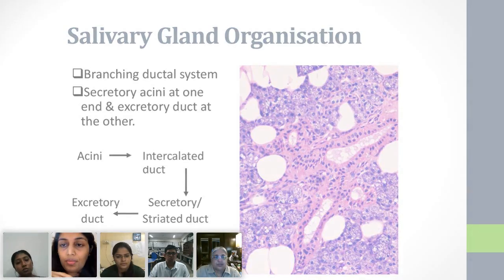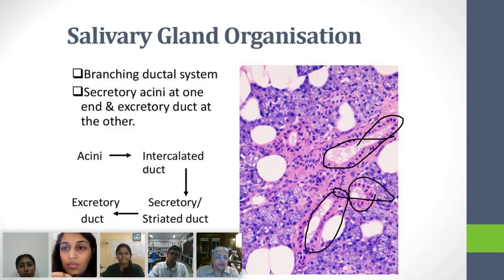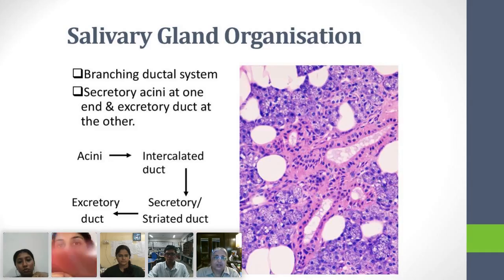And I will show you where that striated duct is. This is the striated duct. Over here, you can see another one, and you see another one over here. It's so pink and it has an oncocytic appearance. It is called, for some reason, the secretory duct. I have never understood why. And then there is an excretory duct. Can any one of you who's taking this, Neelam? Yes, ma'am. Can you show me where the intercalated duct is? I've shown you where the secretory ducts are, the striated duct. Now, show me where the intercalated duct is.